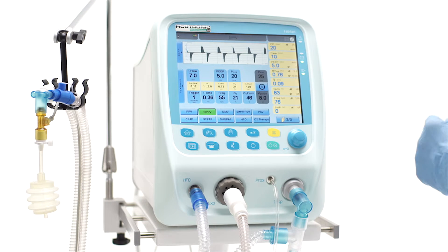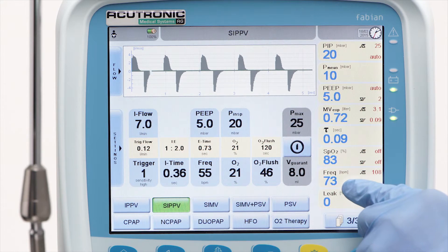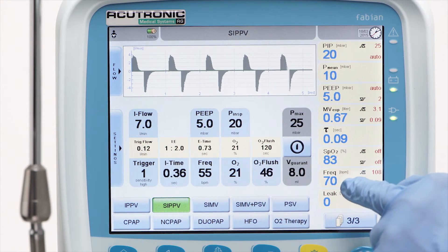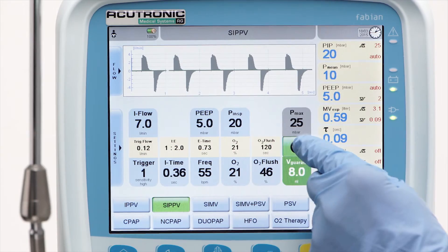Synchronized breaths will be displayed in green color. The amount of breaths per minute — the respiratory rate — is influenced by the patient. The frequency setting will act as a backup frequency to guarantee a minimum minute ventilation. Volume guarantee can be combined with SIPPV.